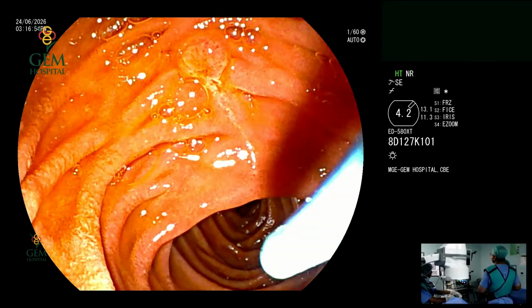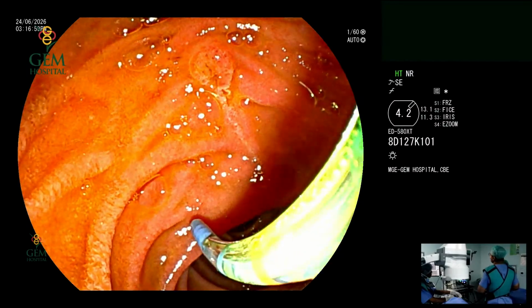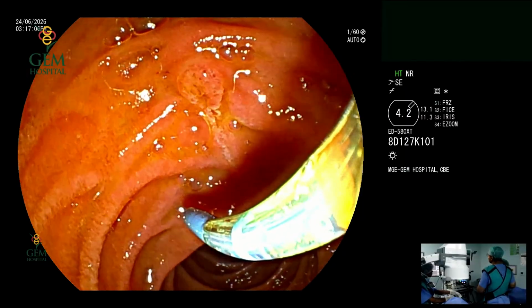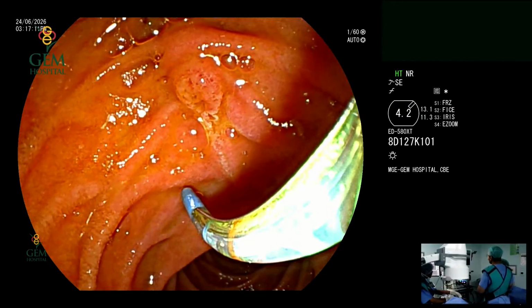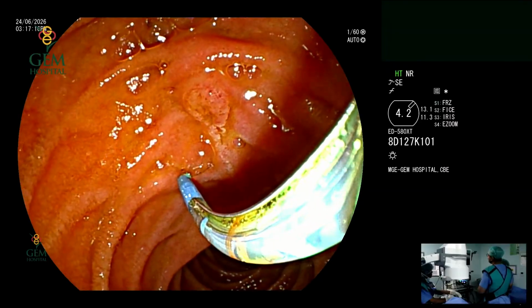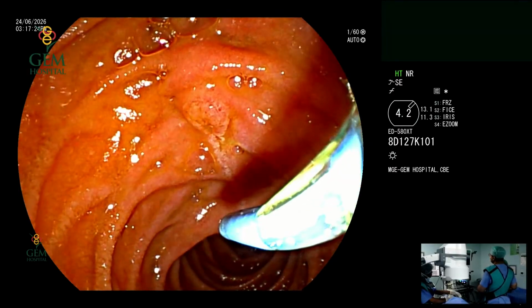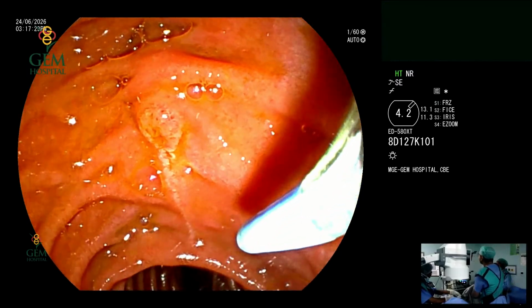So when it comes to the beginners of ERCP, you need to understand the sphincterotome will take a tangential course right from this part of the screen across the screen that way. And the sphincterotome is an instrument which can change its axis also. You can request your technician to bow and unbow. Can you please bow and unbow? And unbow again. So you can ask your technician to do this to make sure your axis is much more established freely. In this case, you don't really need so much bowing here. The right position is mandatory here.